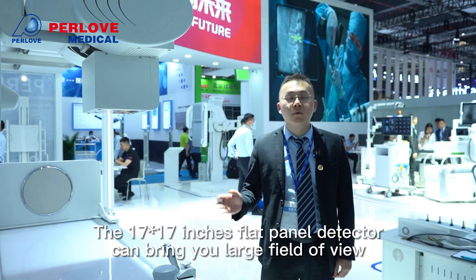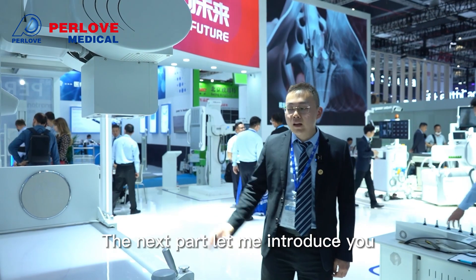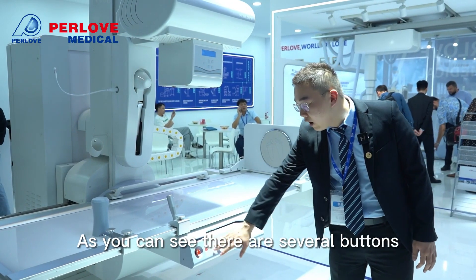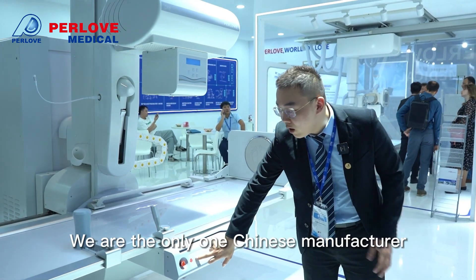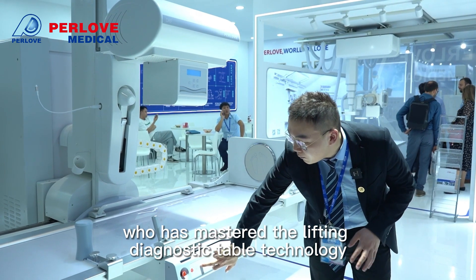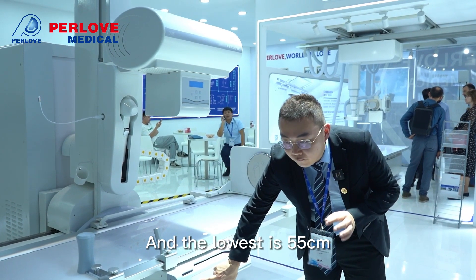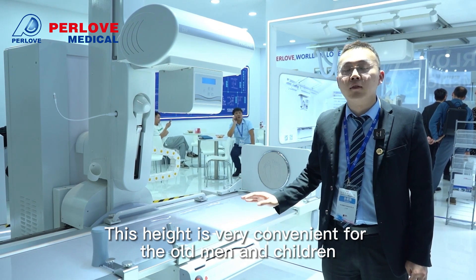The 17-inch by 17-inch flat panel detector provides a large field of view. Now let me introduce the mechanical movement of this medical diagnostic table. We are the only Chinese manufacturer who has mastered the lifting diagnostic table technology. The lowest height is 55 cm, which is very convenient for elderly patients and children.